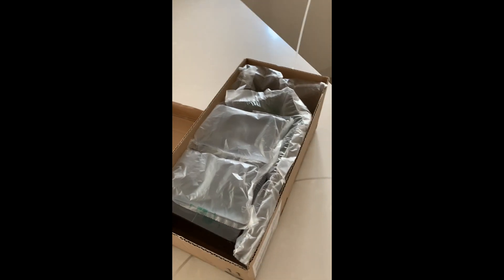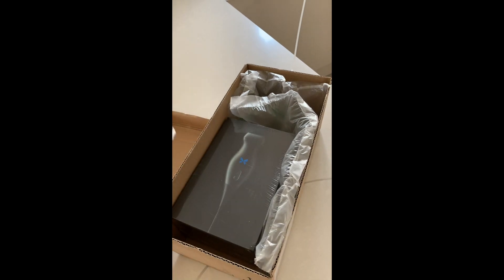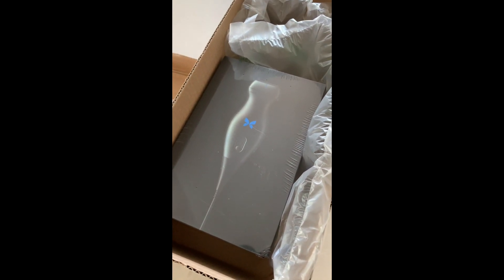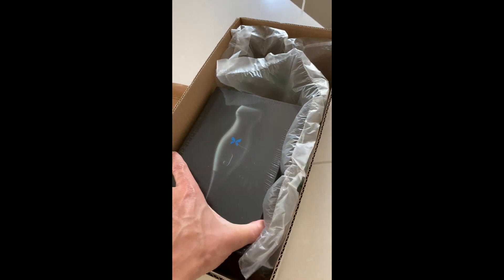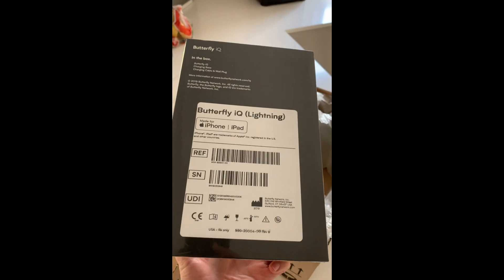Well, whatever it is, it's wrapped in bubble wrapping. It's fragile. Oh my God, can you see that? It appears to be an ultrasound probe. The Butterfly. I just can't express my excitement enough. There it is. It's arrived!